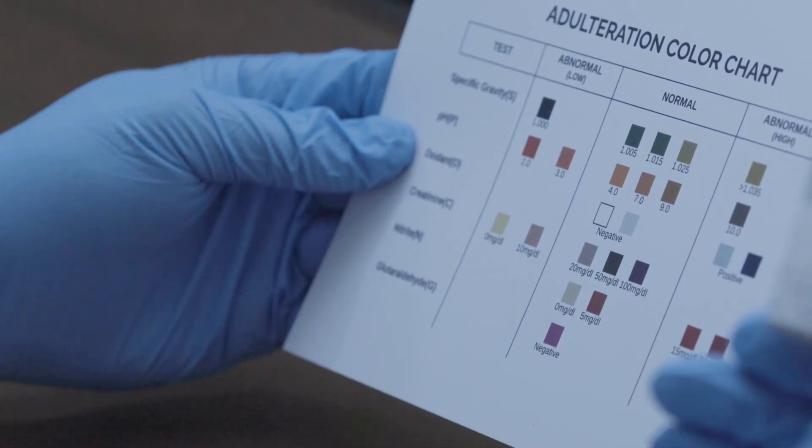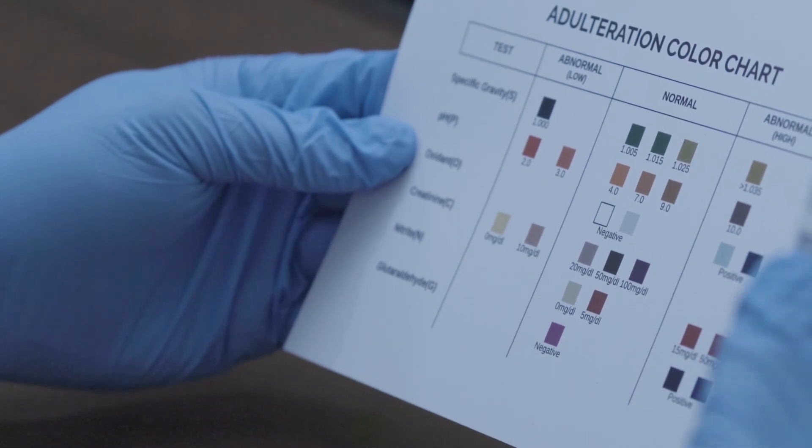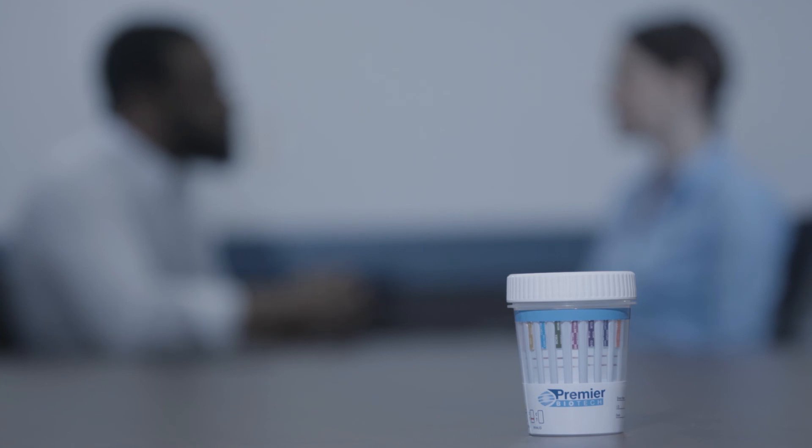Read the specimen validity test results by visually comparing the color of the reagent pads to the corresponding color blocks on the adulteration color chart at three to five minutes. Results are stable for up to 60 minutes. This concludes the Premiere BioCup procedure video.